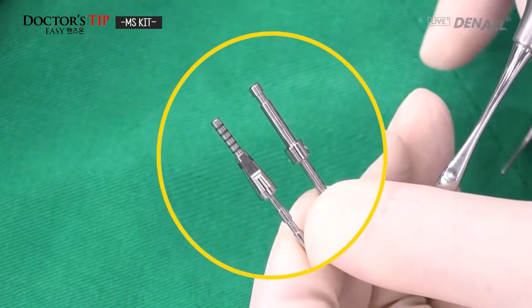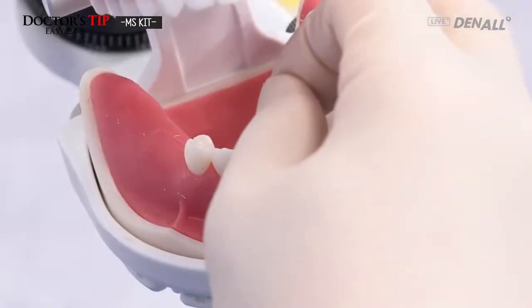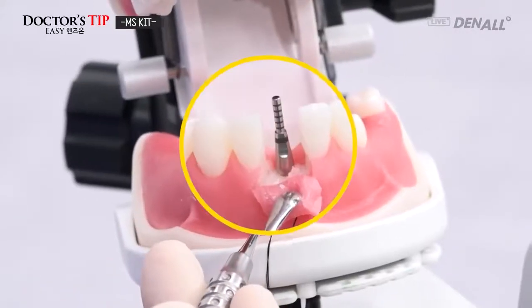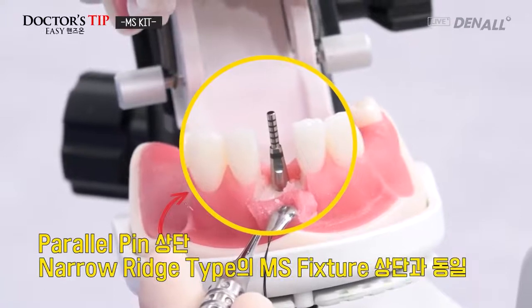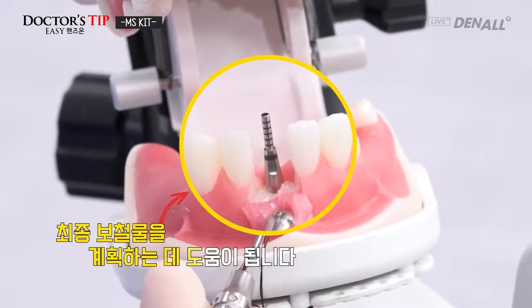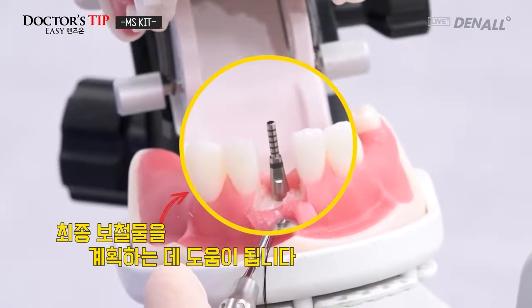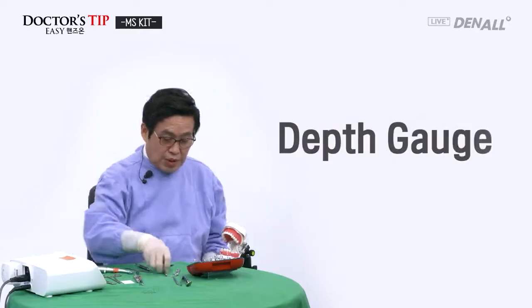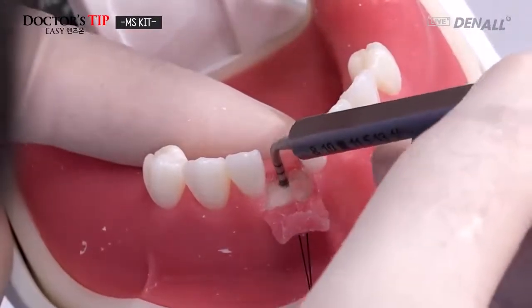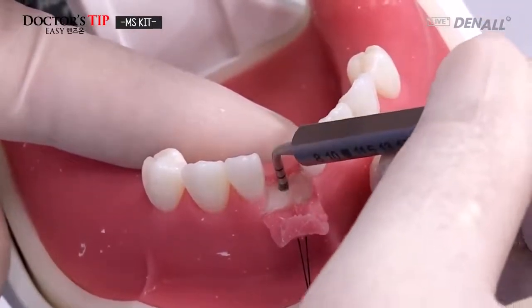Checking the final prosthesis is helpful because it looks the same as the implant. So you push in the guide pin, and like this, the upper part is the narrow ridge type MS fixture. The design is the same as I told you, so it's helpful in planning your final prosthesis. So it's a better guide pin for doing that. Again, I'll check the depth with the depth gauge. And as you can see, it's sufficient, drilled up to 11.5 millimeters.